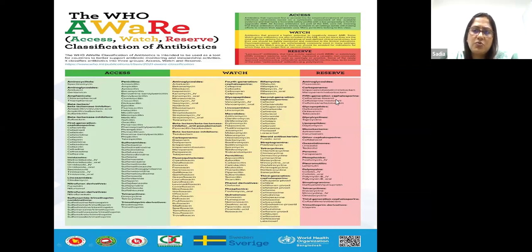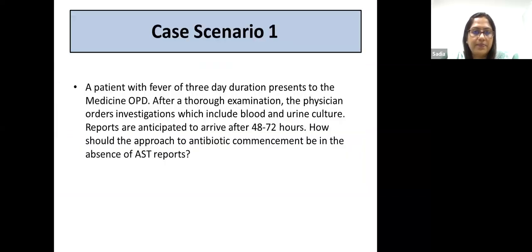So in the cases where we do not release the reserve antibiotics, very often we also have to convey the message to the clinicians. Somewhere we have to strike a balance between suppressing reporting and bringing about a behavior change in prescription practices, because just suppressing the antibiotics is not helping us much in achieving the goal of preventing the misuse of antibiotics.